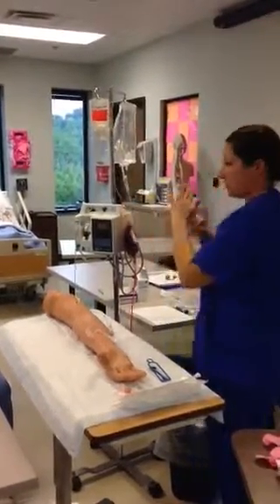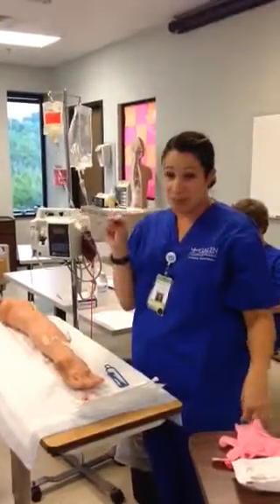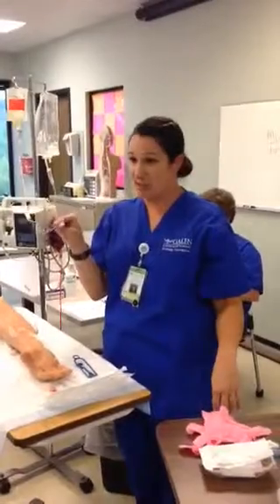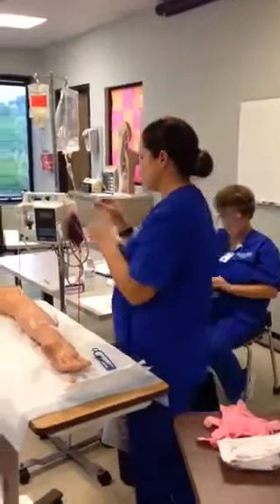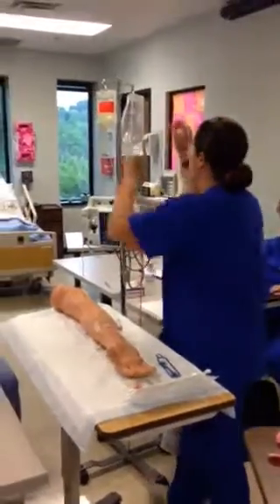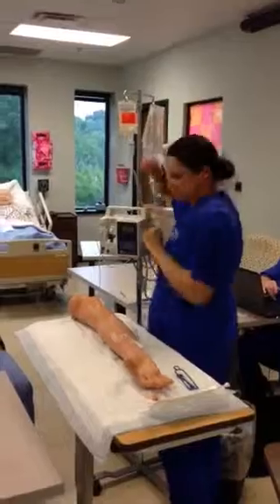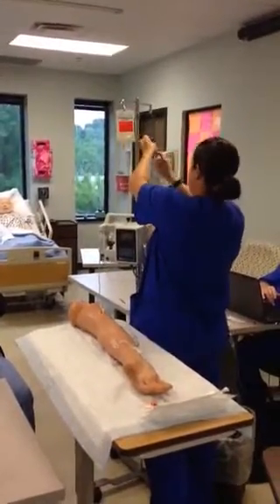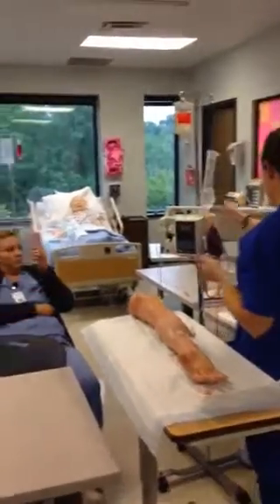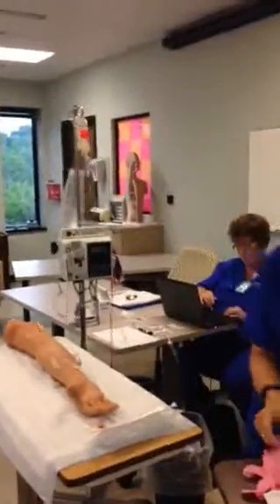Okay, time out for a second. The reason it looks like I wasted so much is because there was already liquid in this tubing. If it had been air, it wouldn't have looked like that. I just didn't want to make you confused. I'm going to make sure that these two are compatible, and they are. I could check in the drug book, or I could call pharmacy if I wasn't sure. I'm ready to put my gloves on.